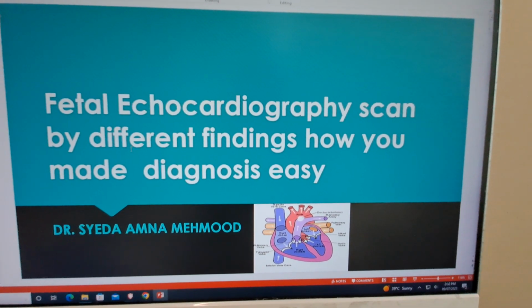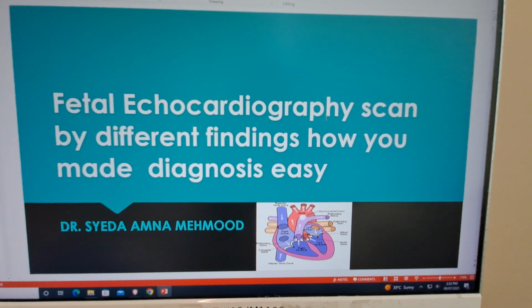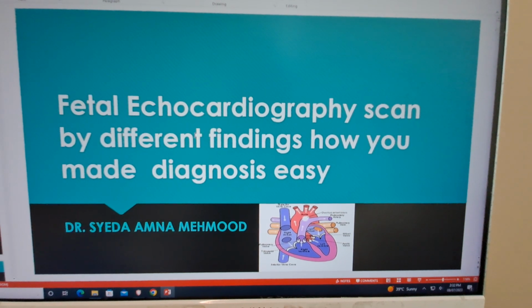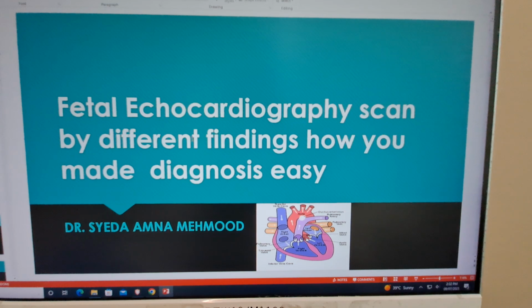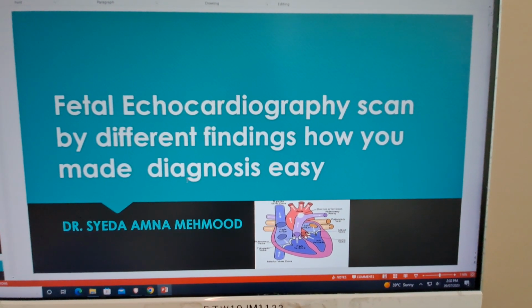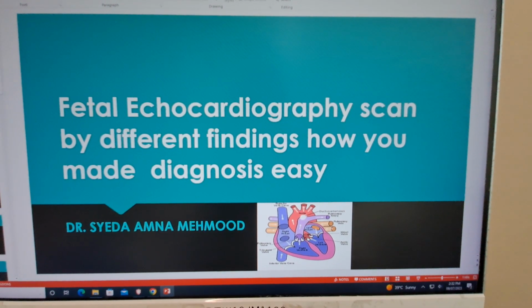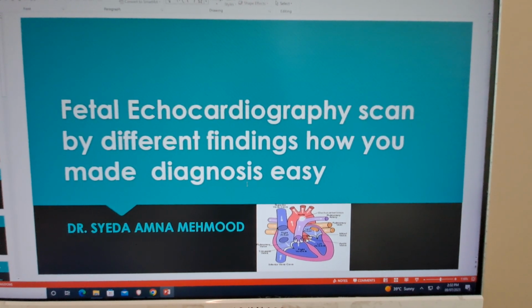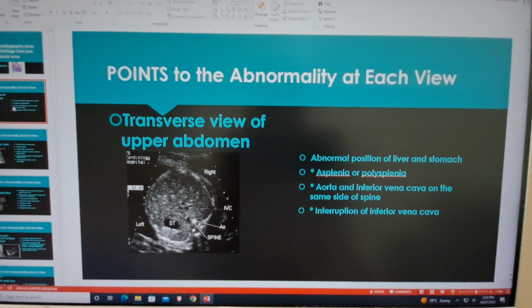Sayyeda Amna Mahmood. Today I selected the topic of fetal echocardiography, and I see very good findings. If you scan a fetal echo, the fetal heart, it is very easy to diagnose. So I made this topic on differential findings, how you can make an easy diagnosis in the fetal heart.